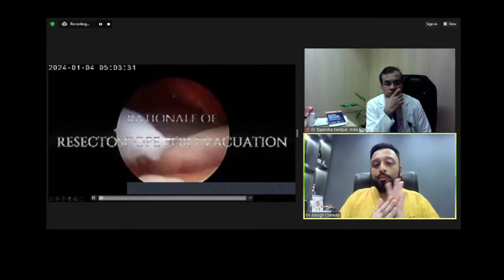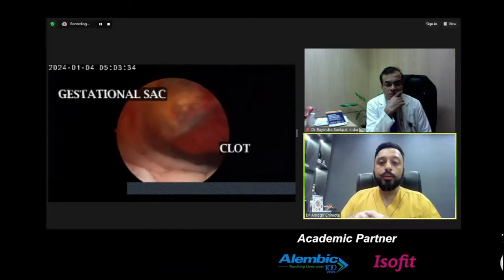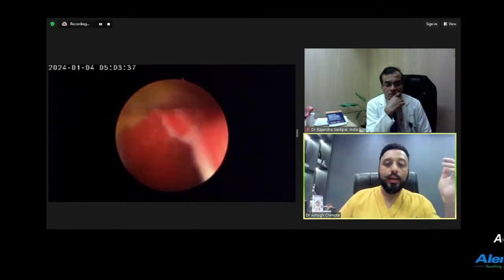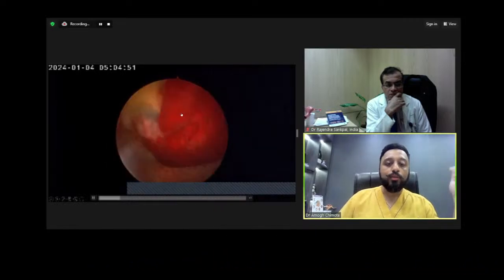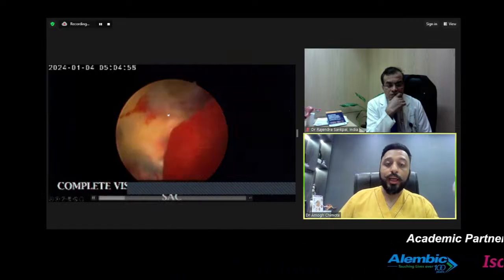This again was a case of early pregnancy loss; this was actually an evacuation for early pregnancy loss. Here, as you can see, there was a big clot, and then you can see a good gestational sac. But again, changes of necrosis and areas of congestion can be noted.